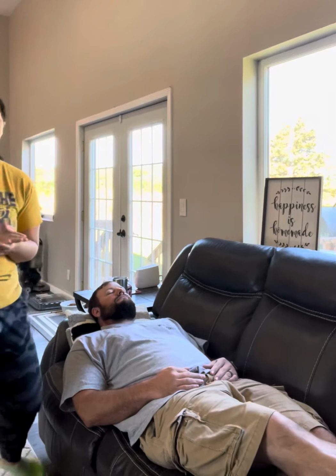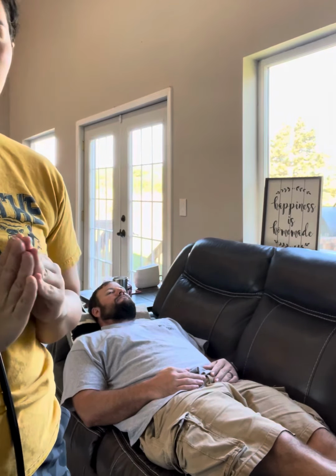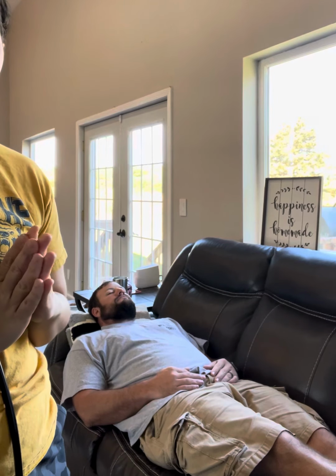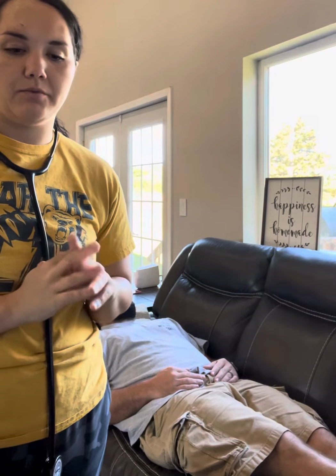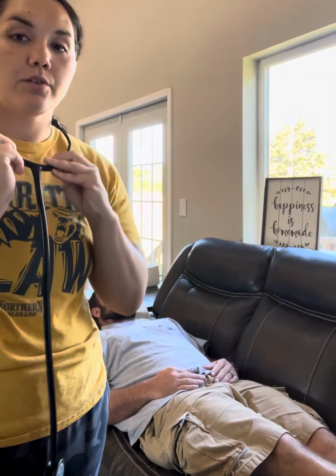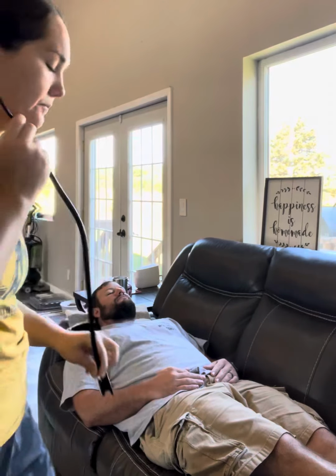And at this time, I would also measure for jugular vein distension for JVP, and on a normal patient, it would be under 3 centimeters. And when I'm palpating the carotids, I'll make sure to check the amplitude and checking for any thrills, things like that. So I'll go ahead and listen over the carotid, checking for any bruits, things like that.